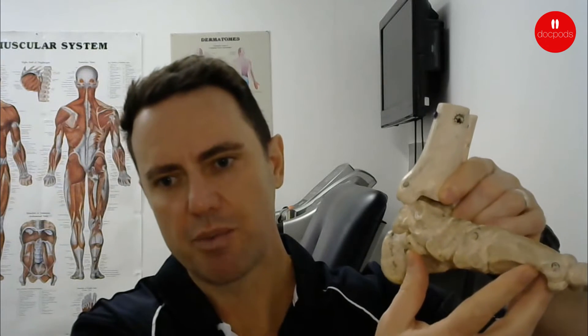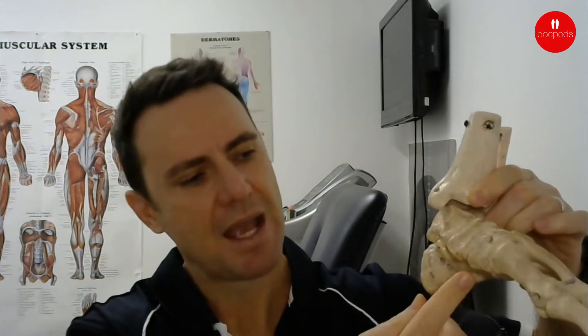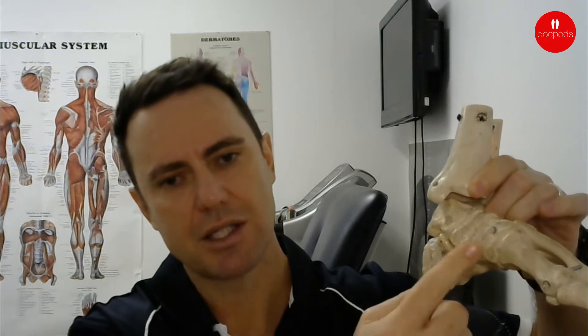This gap here — as we overpronate, this opens up, and the little supporting ligament that attaches between these two joints will actually get strained as we load it over and over again in walking.